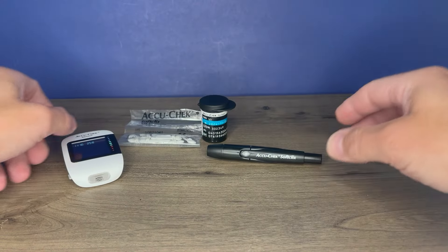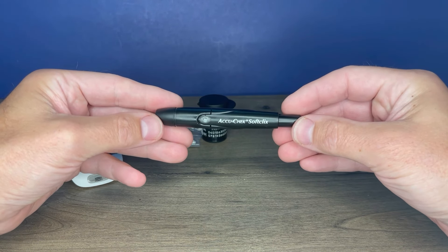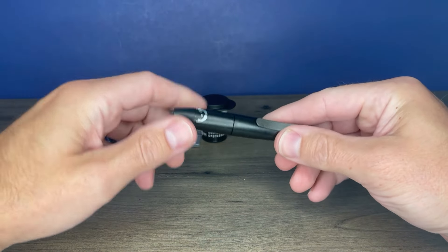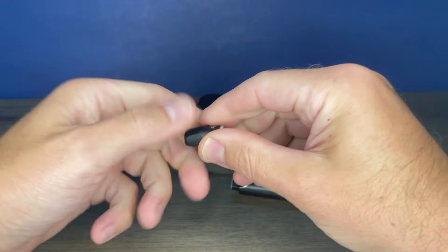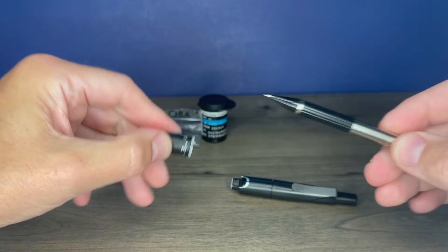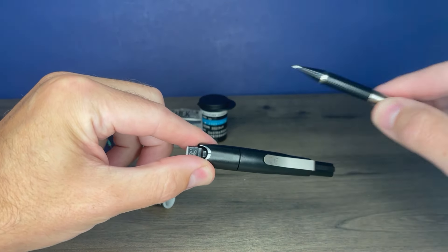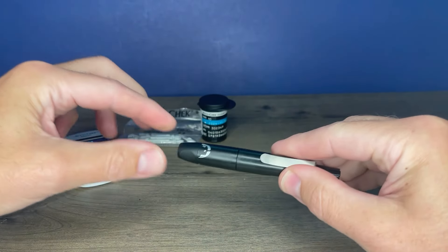Next we'll want to take a look at the lancet device. That of course is what you use to poke your finger to produce the drop of blood. The cap is removed by just pulling it off. Note that the cap has a little notch — that notch needs to line up with the little black line on the lancet device when you reinstall it.